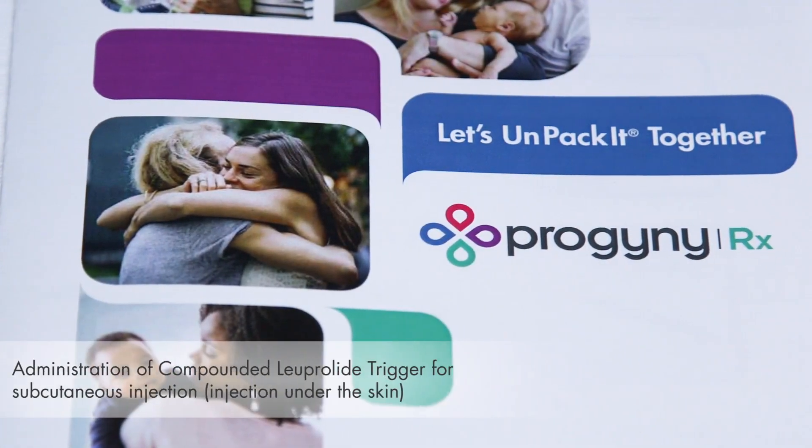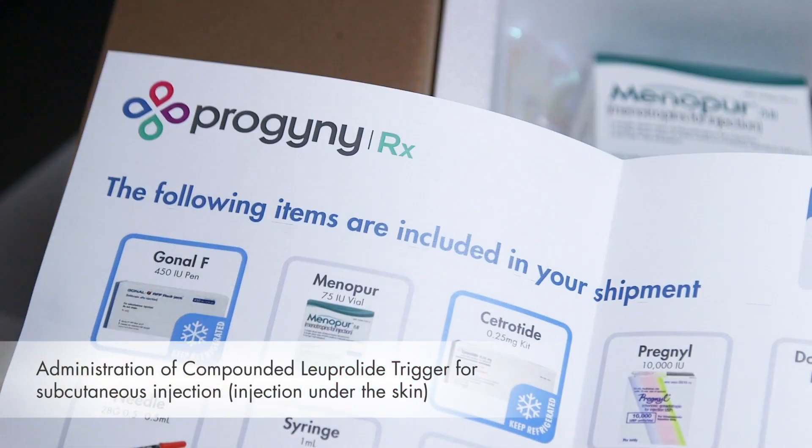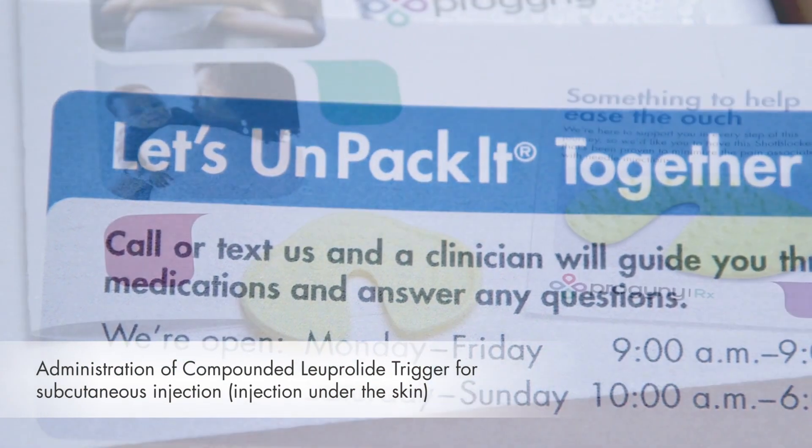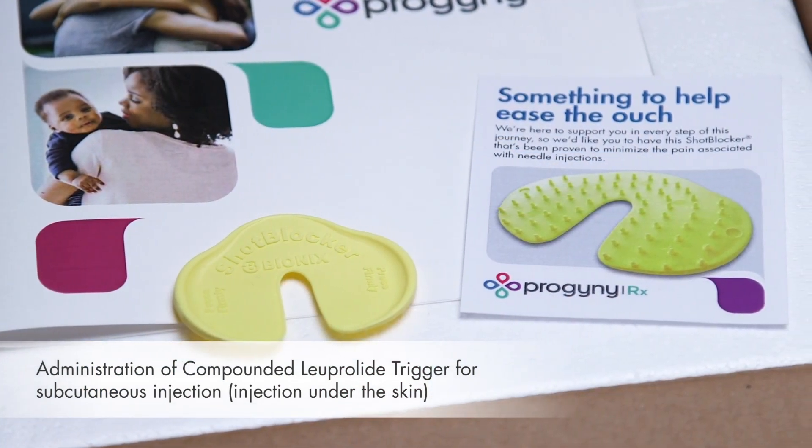Welcome to the Progeny Rx Medication Administration video series. My name is Hannah. I'm a nurse at VFP Pharmacy, a Progeny Rx Pharmacy partner. This video will discuss the compounded Leuprolide trigger.